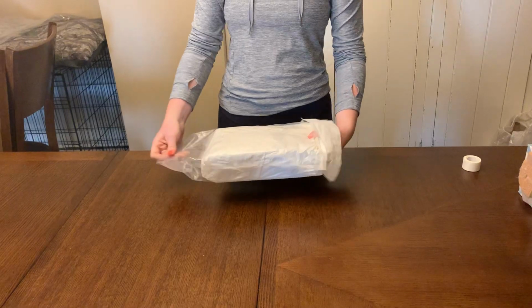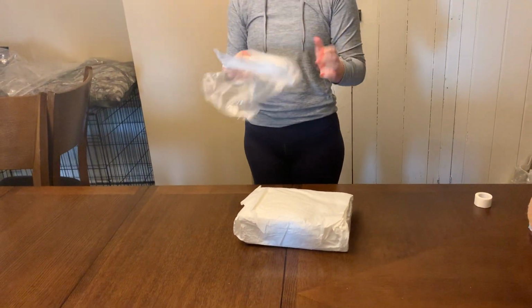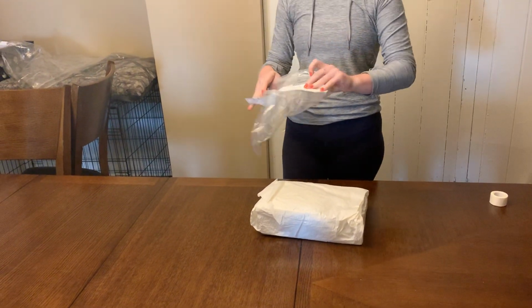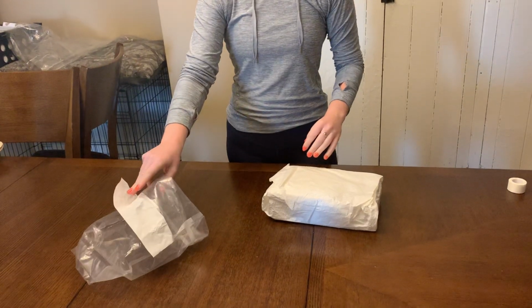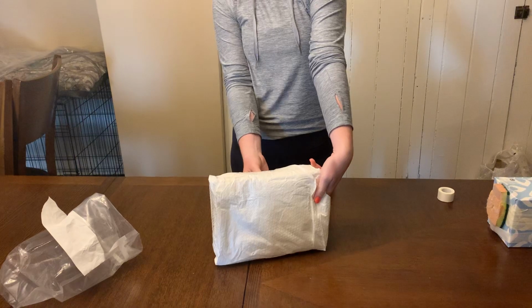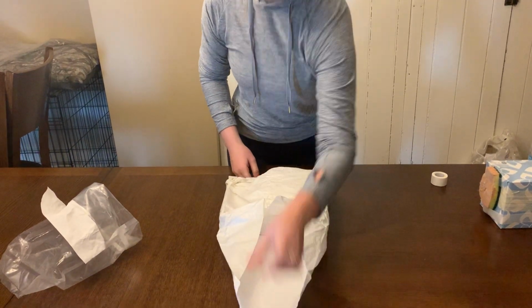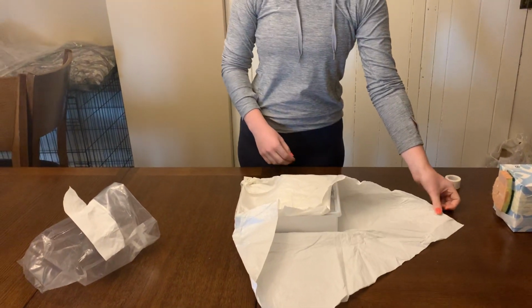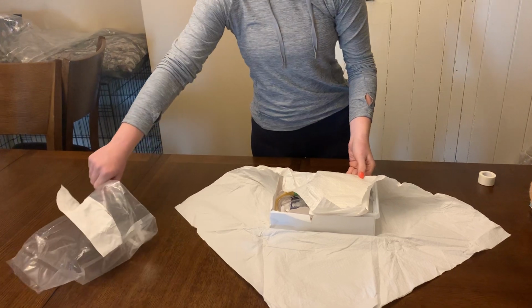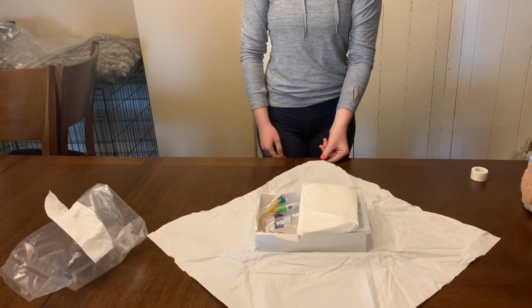So to do so, I'm going to take it out of this plastic bag, and I'm going to open this bag so that I can use this for trash. I'm going to set that over here, and then I will begin to open my kit. I'm going to take the top flap away from me first. Then I'll open the sides. I'm going to scoop this up a little bit. And I'll pull this one back towards me last.